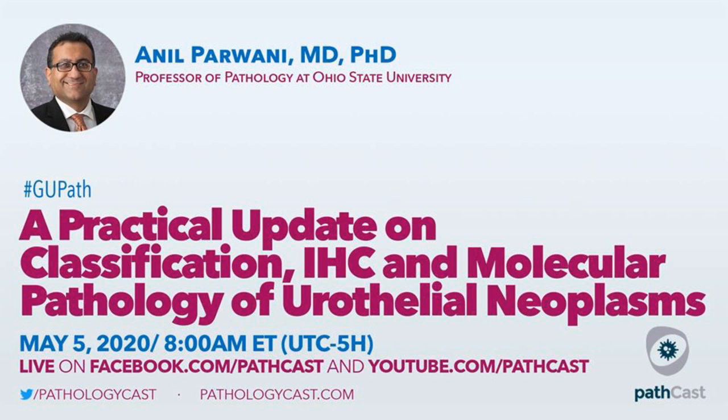So you have to be really careful and be absolutely sure that you do see high grade. What I often do is, if the majority of the tumor is low grade and I see very focal high-grade features, I will call it high grade. But I will put a note that the majority of the tumor is low grade, but there are focal high-grade features. The urologists tend to separate these patients from purely high grade or purely low grade, because they think of this as an evolving lesion. So you have to be very careful in not overcalling something as high grade when it's predominantly low grade.